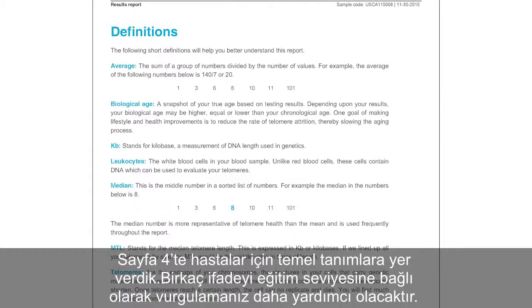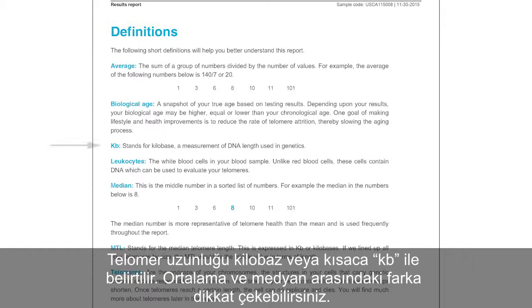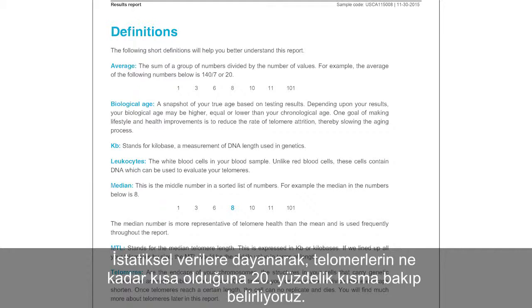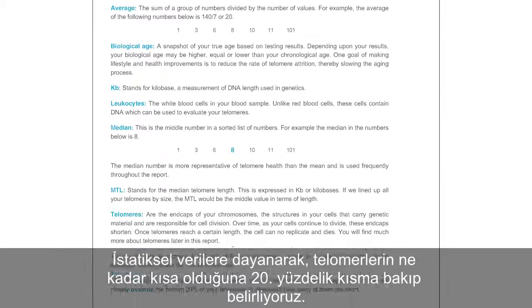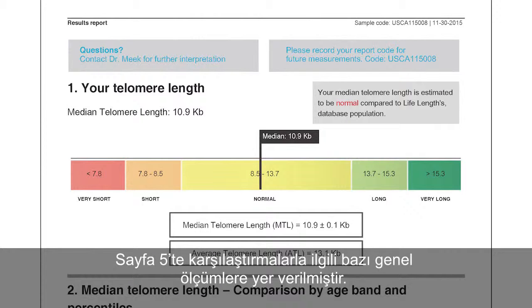Depending upon educational level, it may be helpful to highlight a few of the terms, specifically that we've measured their white blood cells, called leukocytes, and that these are a good reflection of total body aging. Telomere length is measured in kilobases or kbs. You can point out the difference between median and average, or mean, and how the most important measurement of telomere length is the median telomere length, or MTL. You can note that for statistical reasons, we look closely at the bottom 20th percentile to determine how many of the telomeres are short.